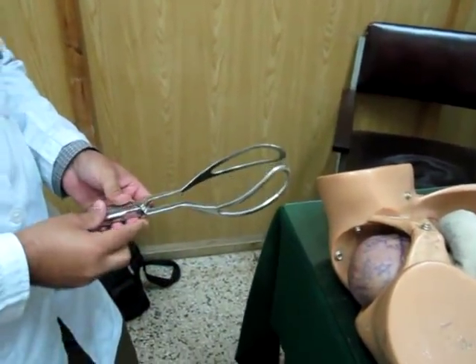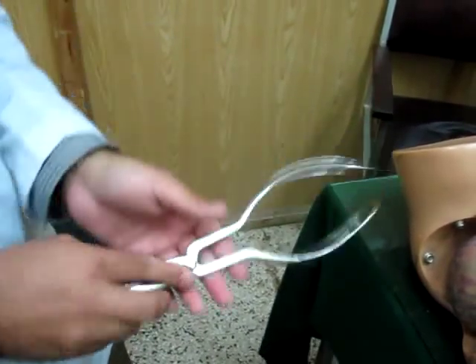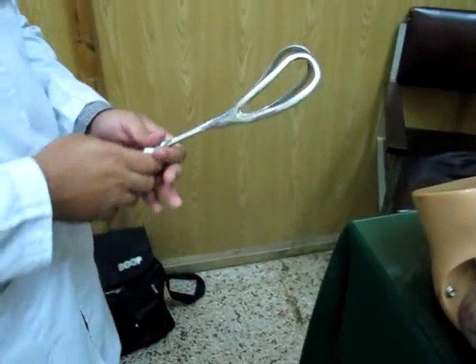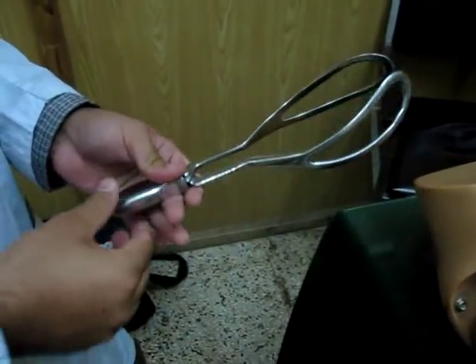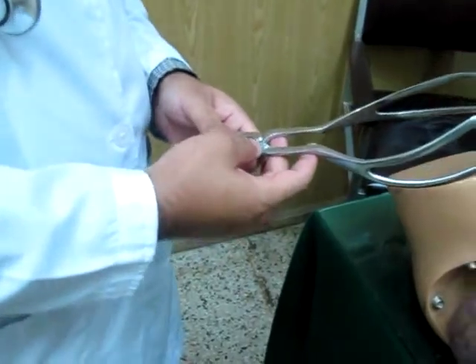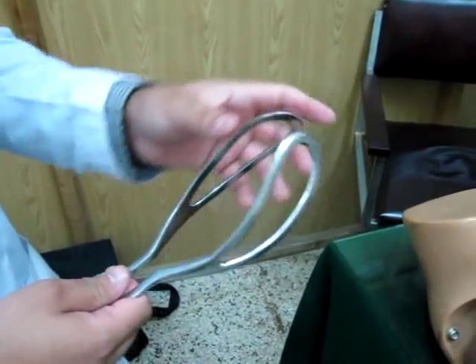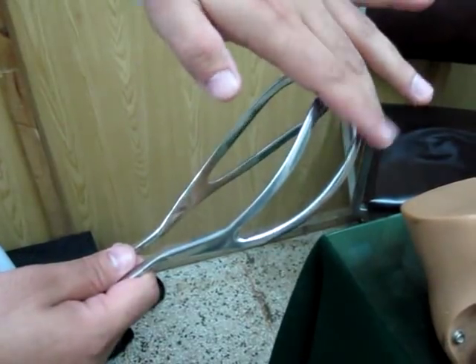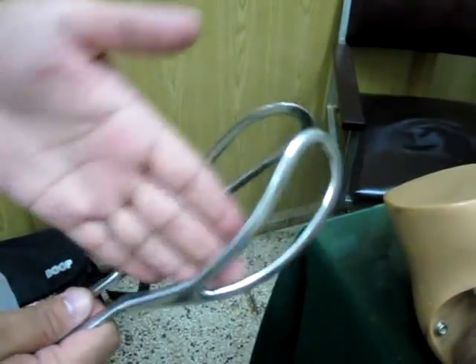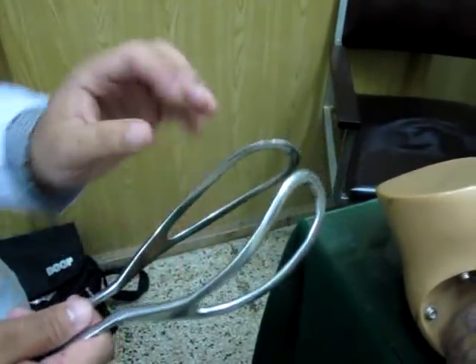If you see the curve coming upward, that is wrong — it should be oriented correctly. As for the parts of the forceps: it has a blade, a shank, a handle, and a lock. There are also two curves: the pelvic curve and the cephalic curve. Cephalic means it fits around the head.